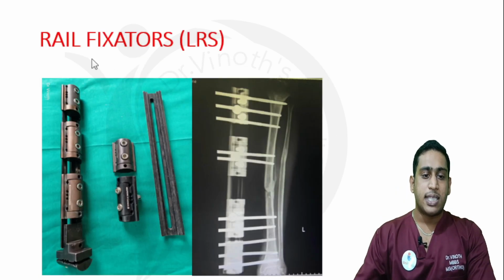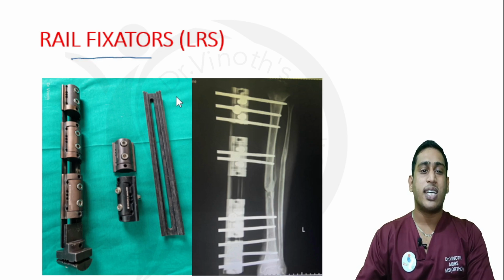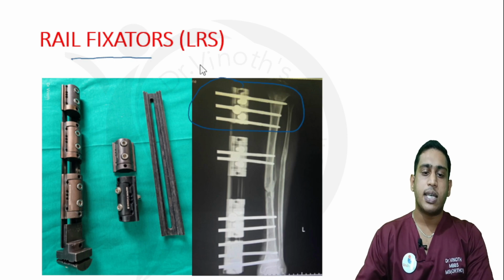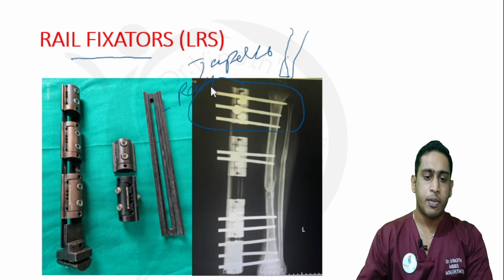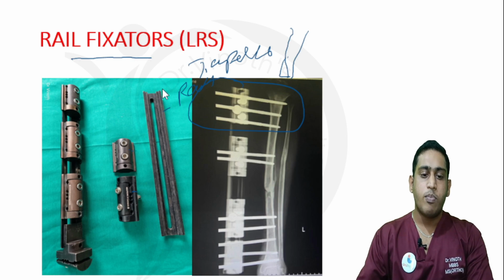Now coming to the second type of the pin fixators, they are called rail fixators, also called limb reconstruction system. Here we use a specific type of SCHANZ pin called a tapered SCHANZ pin, which means the thickness will be tapering from top to bottom. That's why it's called a tapering SCHANZ pin. So what are the components? This is called a rail. This one is the mobile clamp, and this one is a fixed clamp. The mobile clamp will be movable on the rail, and the fixed clamp will be fixed to the rail. And this is a T-shaped clamp for the articular surface or the condylar surface.